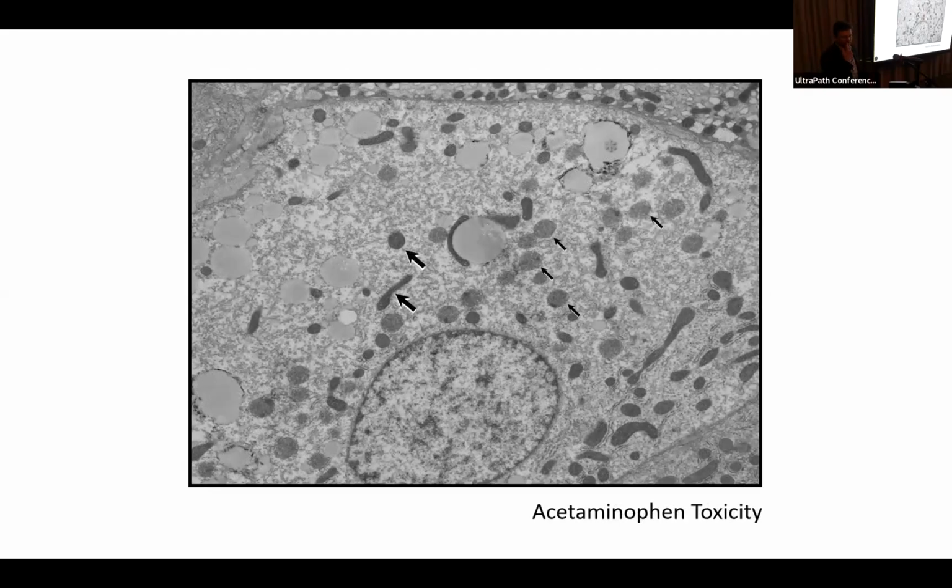However, now what we run into is Tylenol intoxication. And if we're giving kids Tylenol for their fevers instead of aspirin, this is a fairly common cause of acute liver failure in children also. And here you can see that we still have the microvesicular lipid, but instead of having the mitochondria swollen, they're not. And what you can also see here is a proliferation of peroxisomes, which are there because that's their job, to do the detoxifying of certain chemical agents.